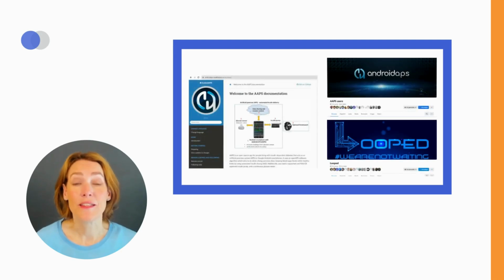Remember, you are not expected to embark on this journey alone. The AndroidAPS community is there to support you every step of the way. So, have confidence, seek help when needed, and refer to the extensive documentation as you work towards achieving optimal glycemic control with AndroidAPS.